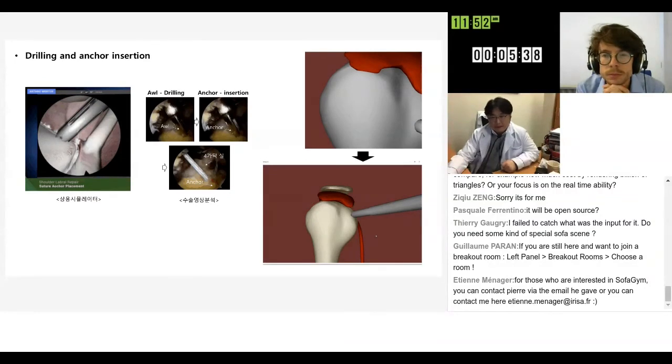In another task, we needed to combine the motion, so a combination of mesh modification and moving the hard and soft parts of the simulated contents.